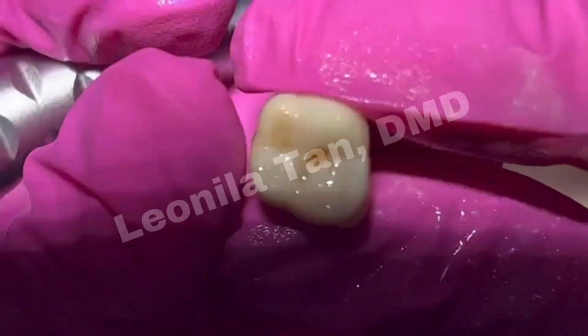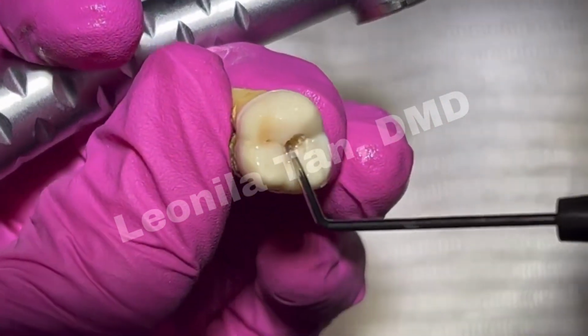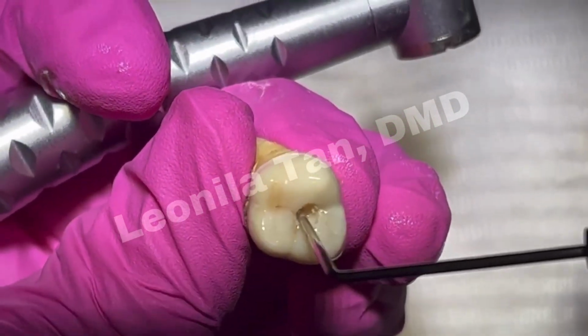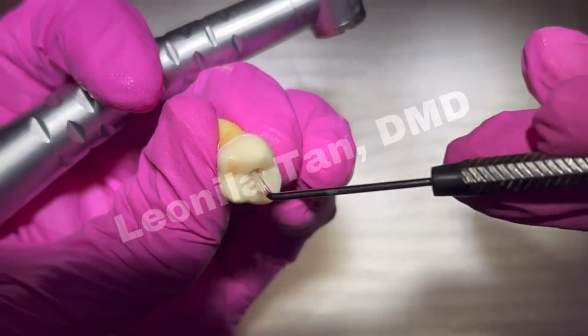Never use a flattening motion. Then check with your Endo Explorer to see that you're in the right direction.